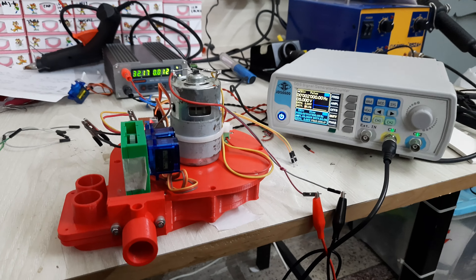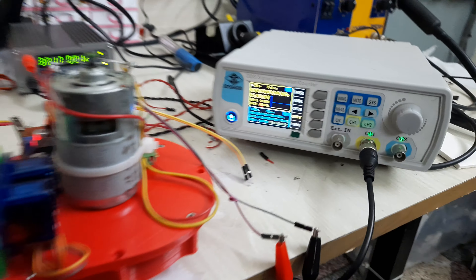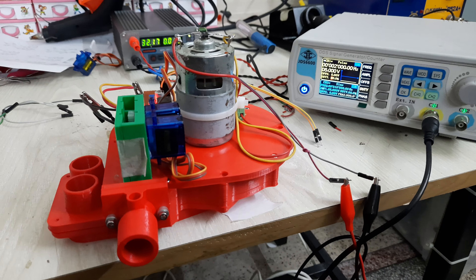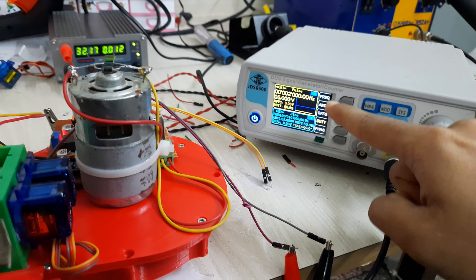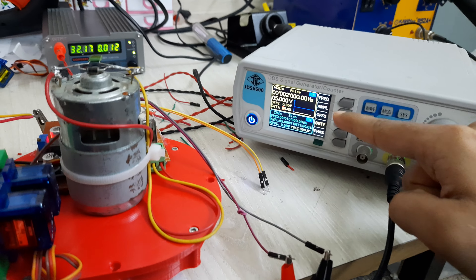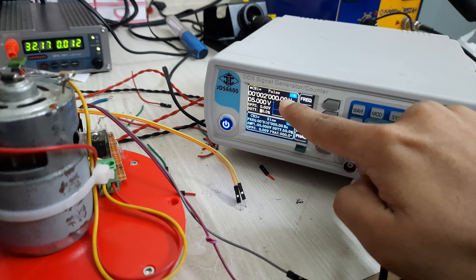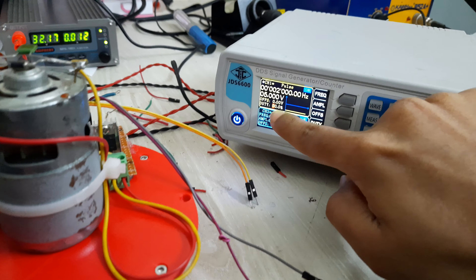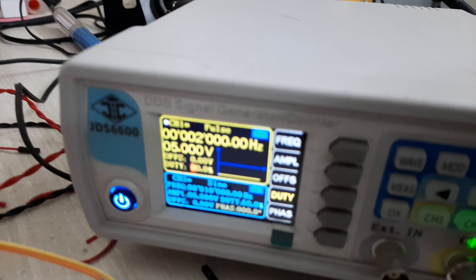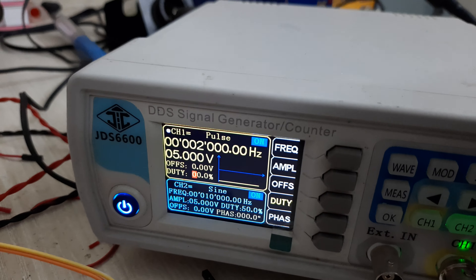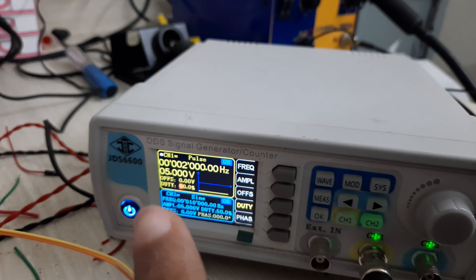Hello, this is Nabil from the Krabs open ventilator team. We are going to control this turbine using PWM — pulse width modulation. I am applying a 2 kilohertz frequency square wave, and I am going to control the duty cycle from this signal generator.